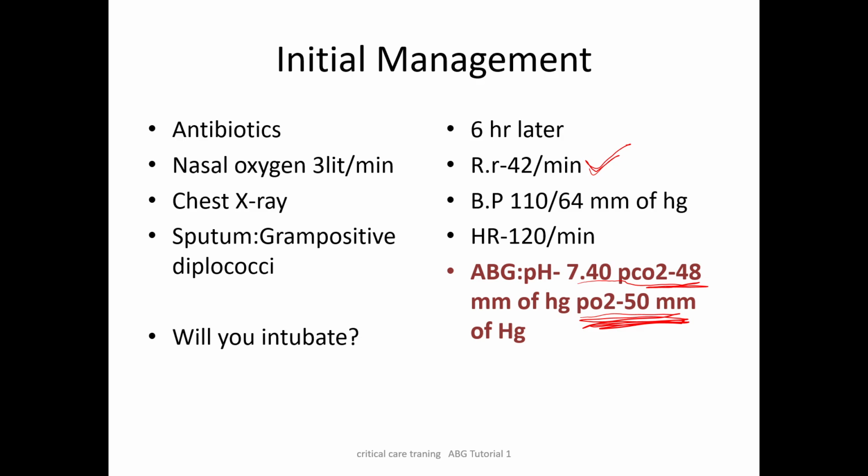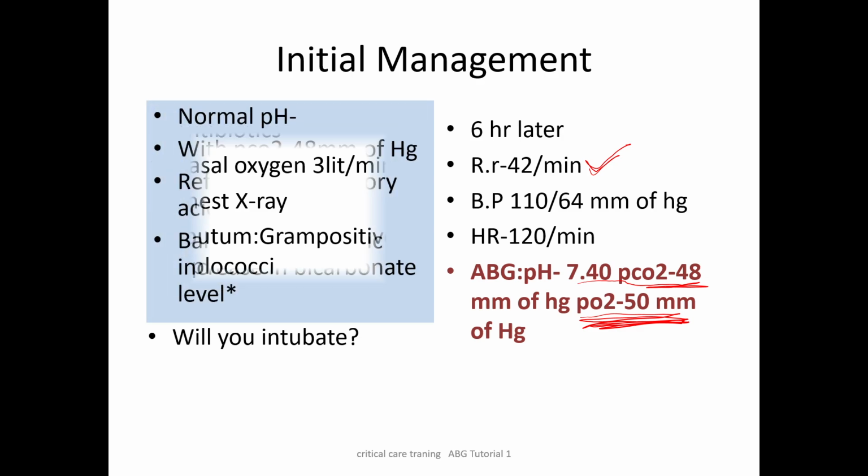And this is the time you have to integrate the values of clinical, and you have to decide to go ahead with invasive ventilation, because this shows the respiratory acidosis. Despite so much tachypnea, respiratory acidosis means the patient is fatiguing. pH is looking normal, 7.4, but PO2 is a severe respiratory failure, type 1 plus type 2 respiratory failure. So PO2 is less than 50. So this patient, though hemodynamically stable, will require the invasive ventilation, and there is a worsening of the condition.